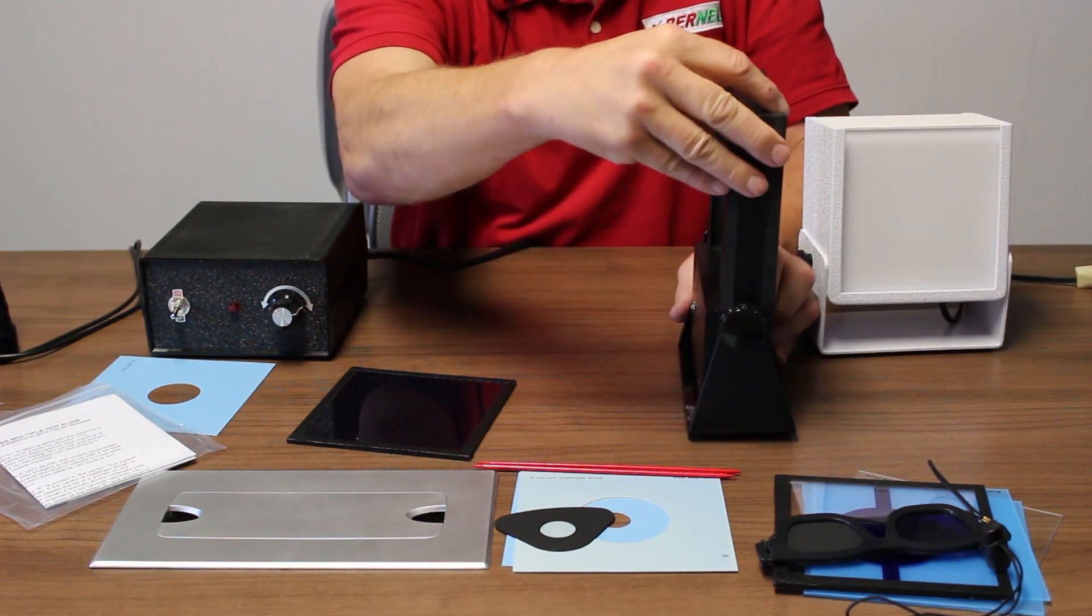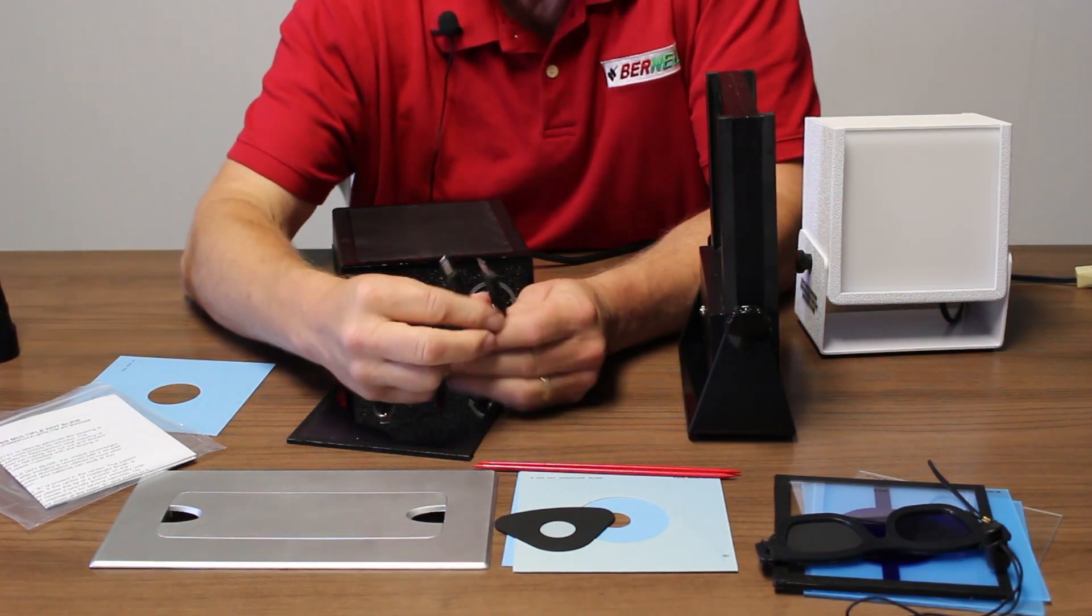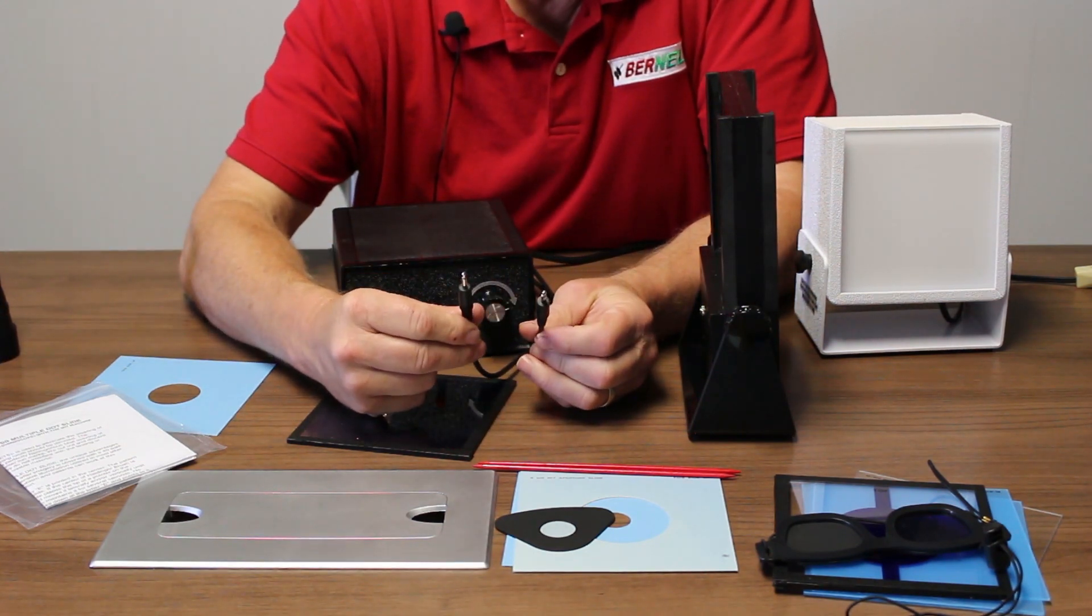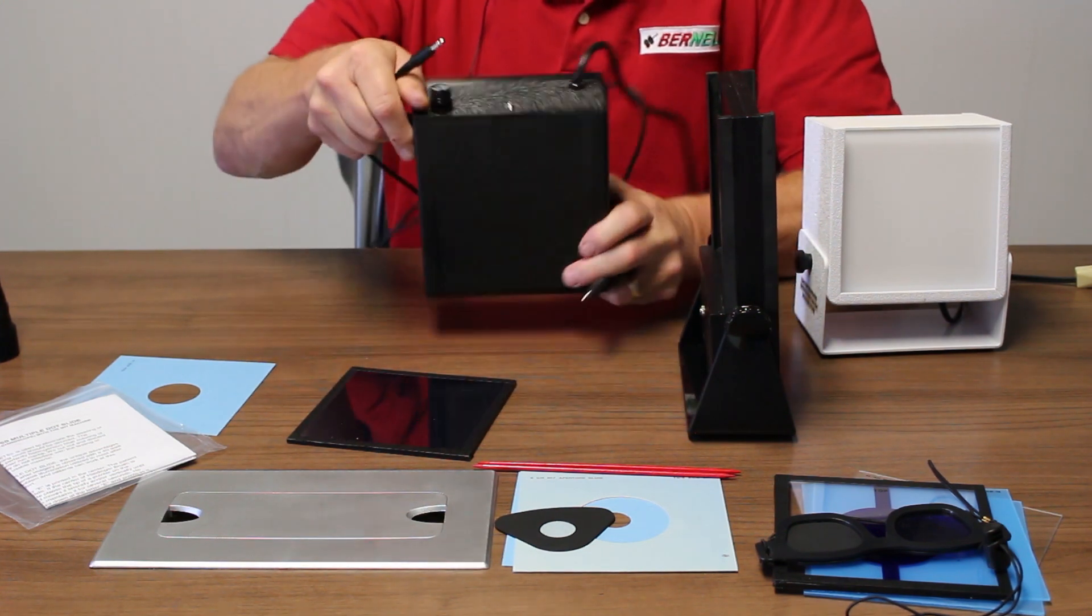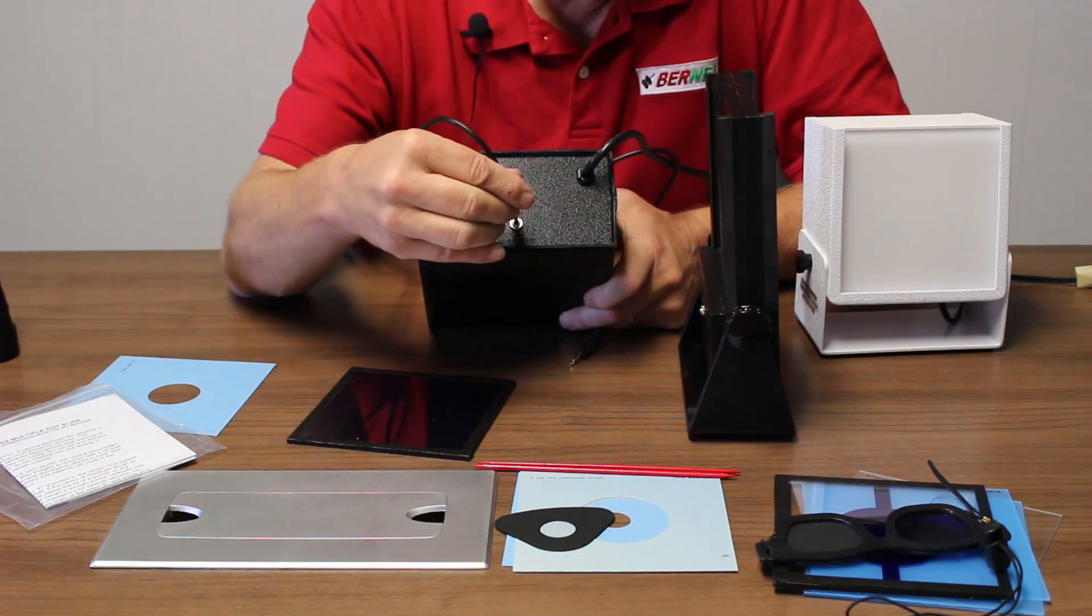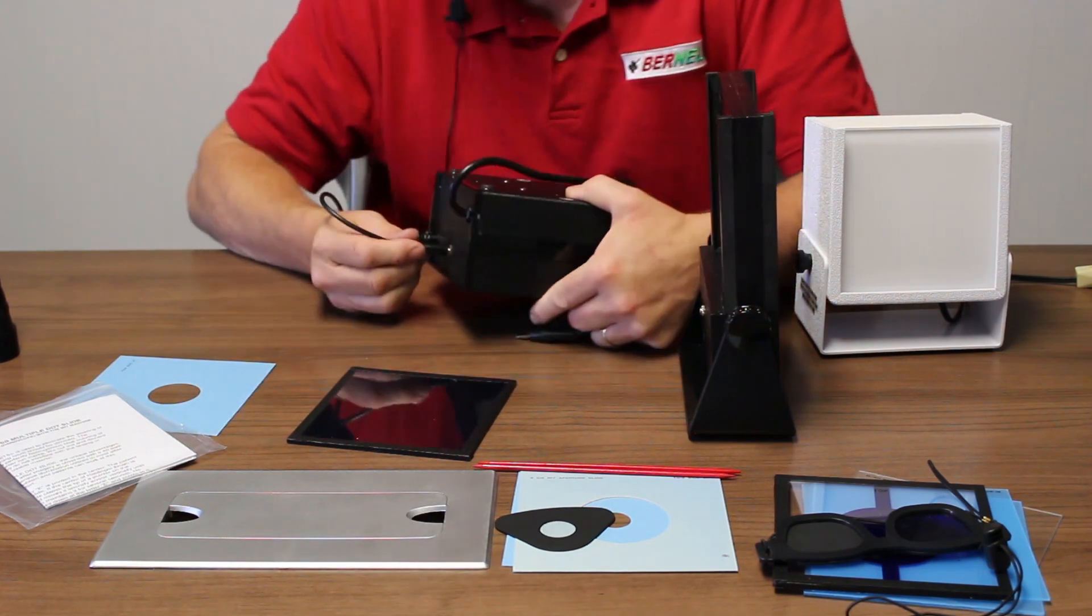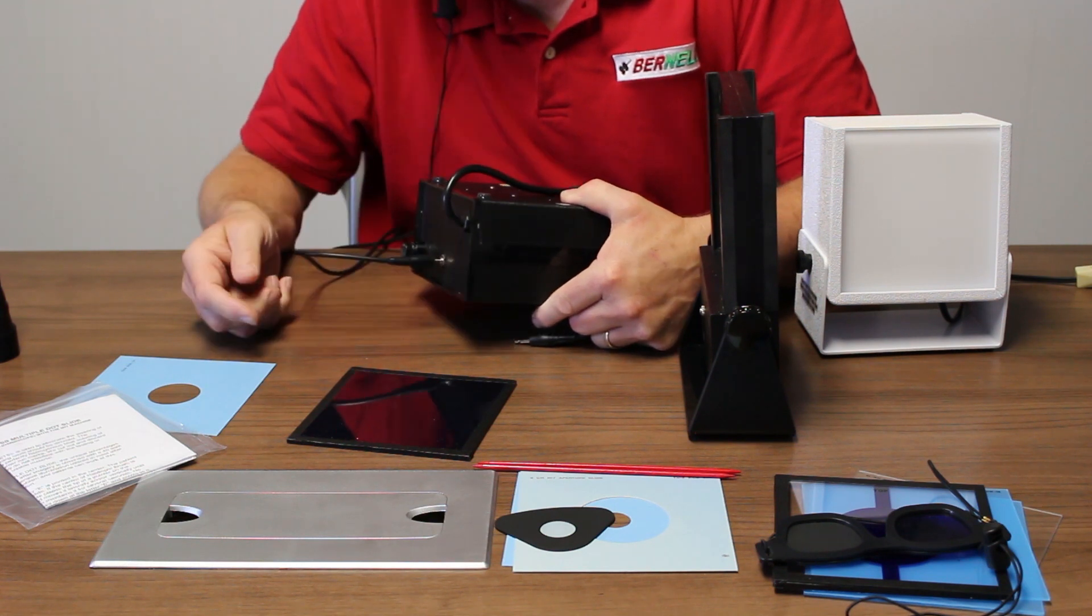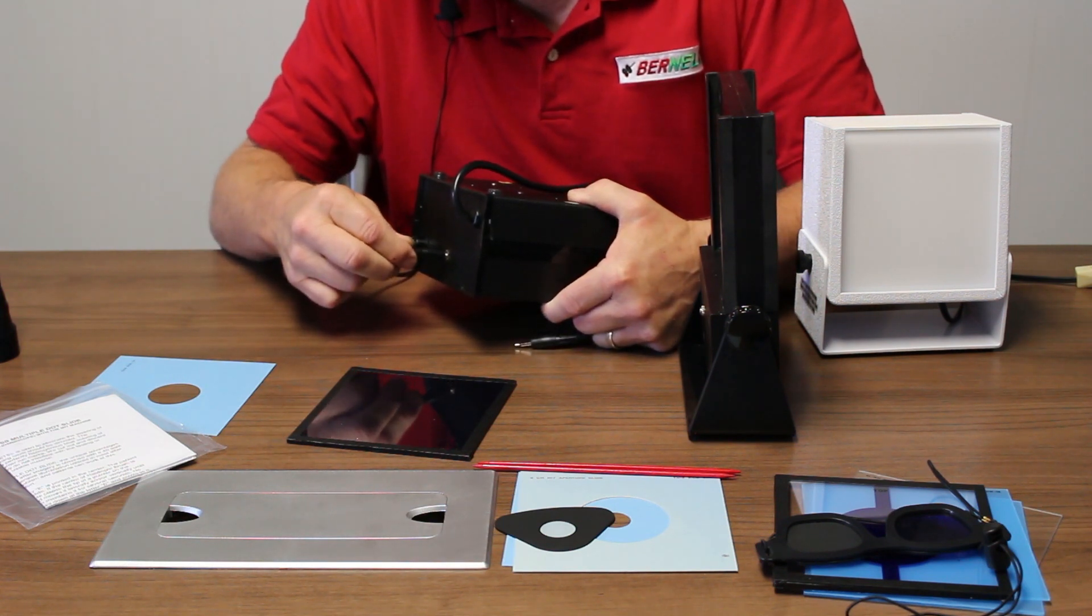Once you have that assembled, grab the power supply cable. Notice this cable is the same on both ends, so it doesn't matter which end you put in which device. There's an RCA-like plug on the back. Make sure you get it all the way in so it's snug. If you only have it part way in, it's not going to make a good connection.